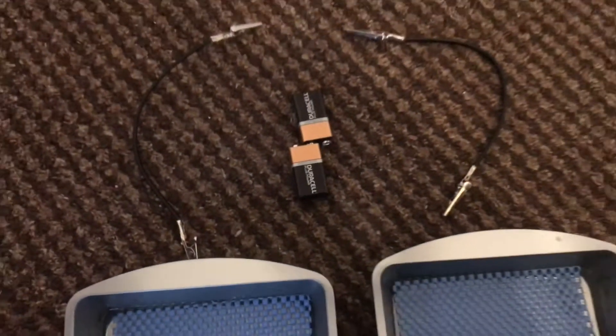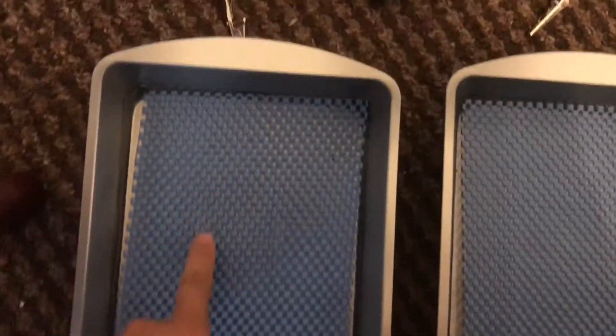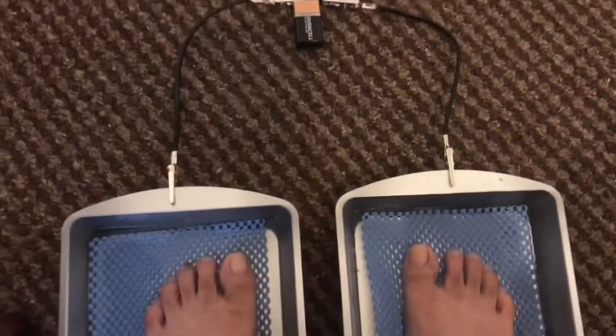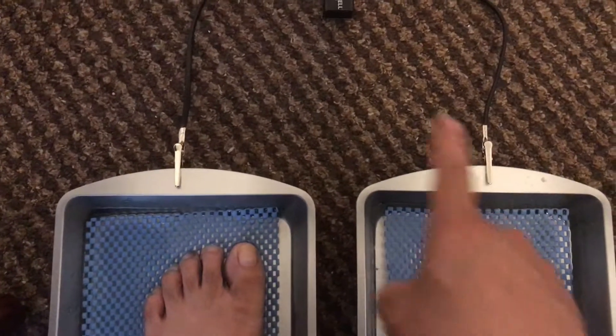And water from the top — if you can see, there's water already here. And this is a pan. The positive here and the negative here.